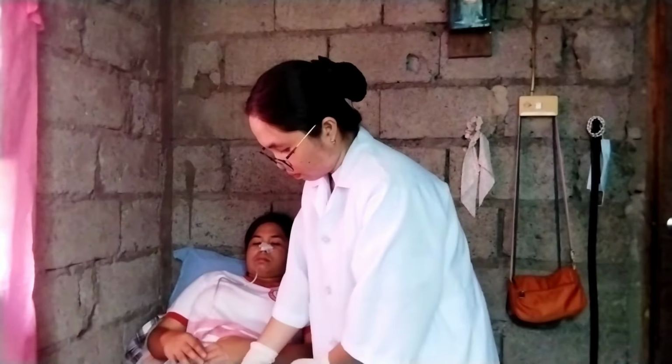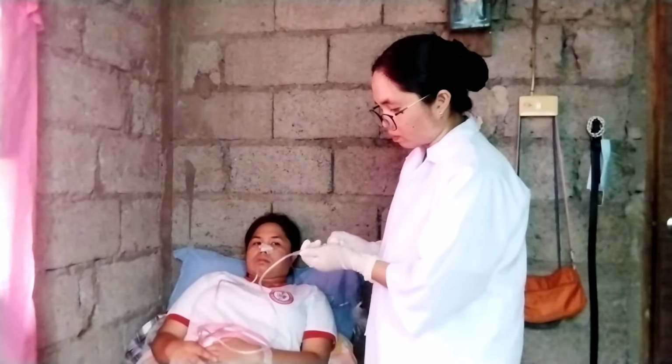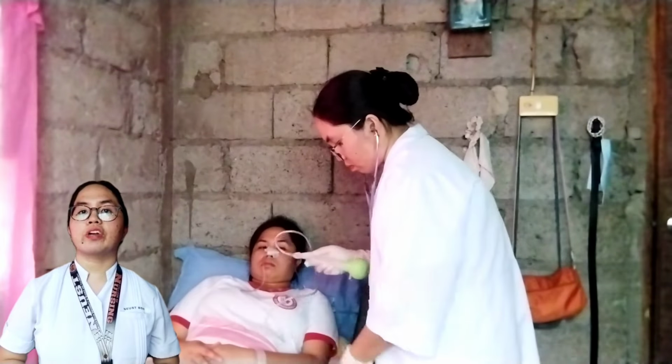Attach the syringe to the open end of the tube and aspirate. Check the pH. Allow 1 hour to elapse before testing the pH if the client has received a medication. Use a pH meter rather than pH paper if the client is receiving a continuous feeding. Follow agency policy if the pH is equal to or greater than 6.